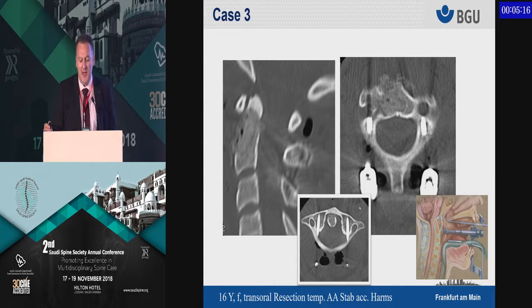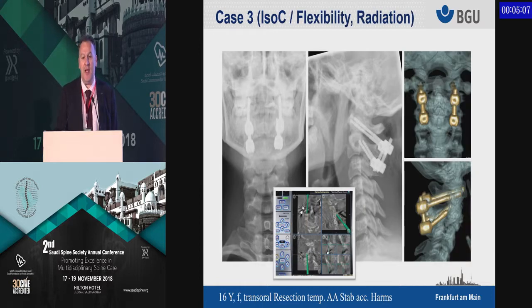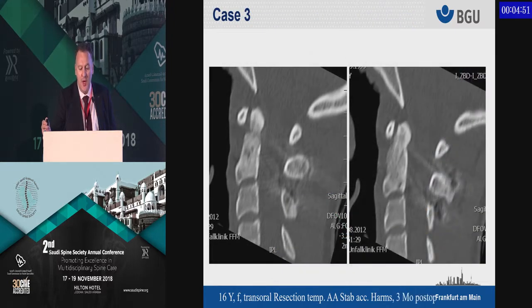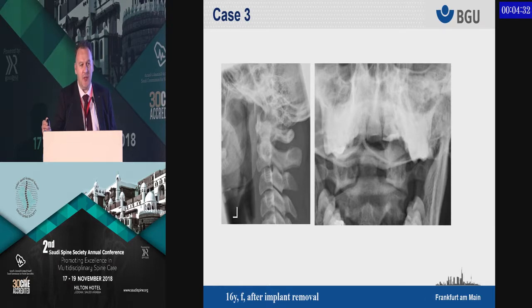You perform an additional protective stabilization to make sure it's not breaking. After resecting the cyst, you fill it up with bone grafts via the transoral approach. This is done with the Iso-C fluoroscopy scanner — it's highly flexible with less radiation for the young lady. After three months the gap fills, the bone graft rebuilds the odontoid, and after six months the complete odontoid is refilled with bone, allowing removal of the protective stabilization and return of mobility.